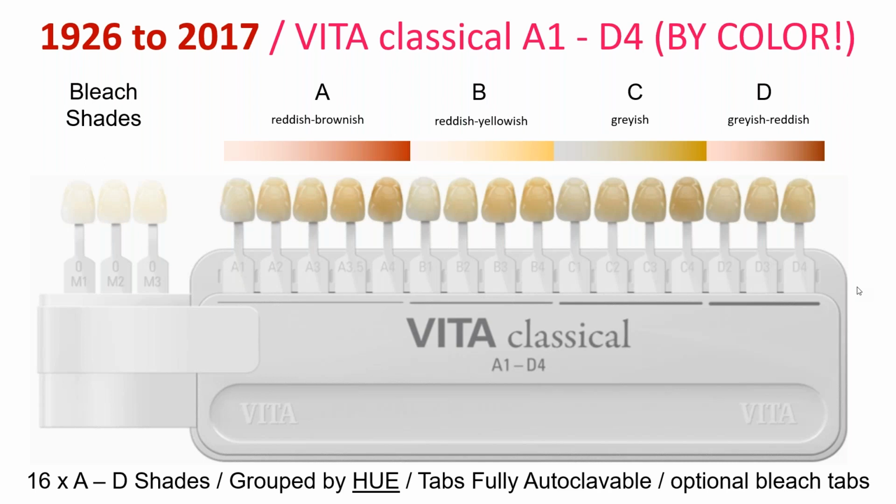The D is grayish reddish. For the most part, for natural teeth, the Cs and the Ds in human dentition are relatively rare. When we look at the grayish on the C, we're primarily looking at the incisal, the translucency. We like the Cs mainly because of the grayness to them, and we often do prescriptions that have a C component with an A or a B. And then, of course, you've got extended ranges of bleach, which are non-natural, as I mentioned. These are the 0 range.